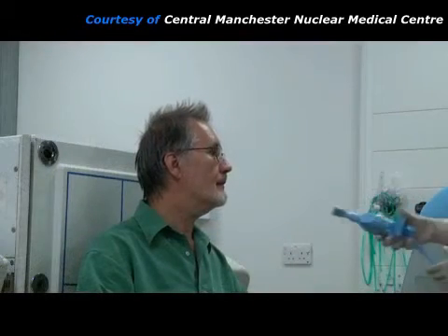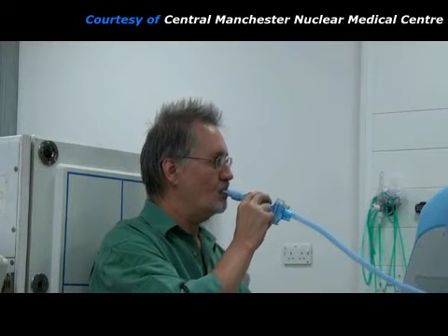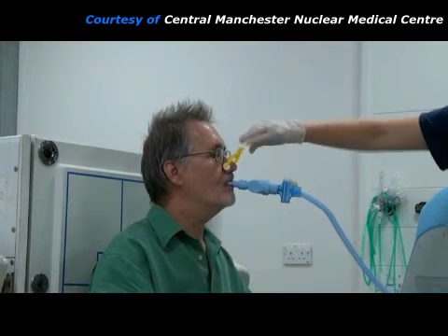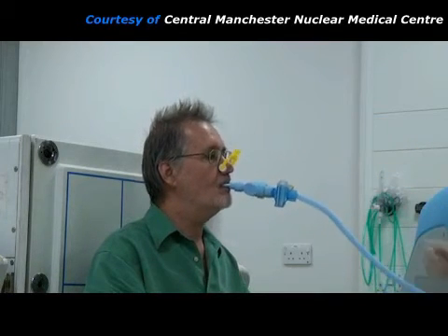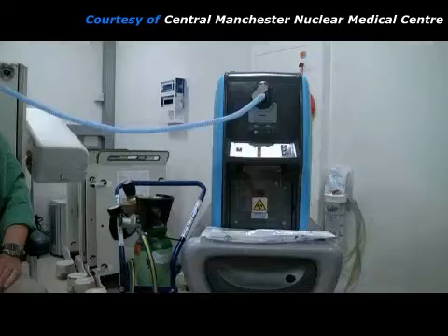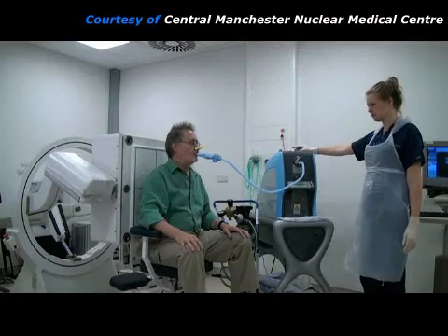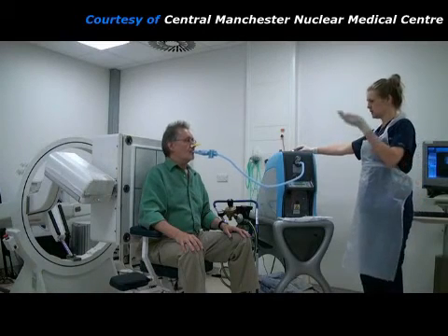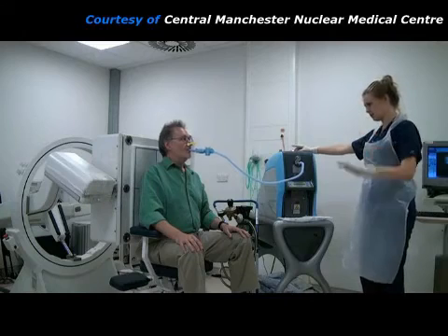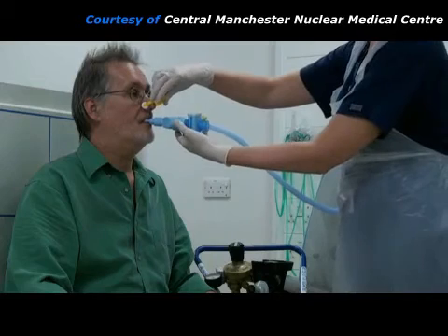An alternative method of obtaining the ventilation pictures is for the patient to breathe in an aerosol of small radioactive particles. For this, the patient is fitted with a mouthpiece and a nose clip. The aerosol can be produced in a machine like this. The patient takes a few deep breaths, which allow the particles to deposit in his lungs in proportion to the air flow. Then the mouthpiece and nose clip can be removed, and the ventilation pictures are taken.